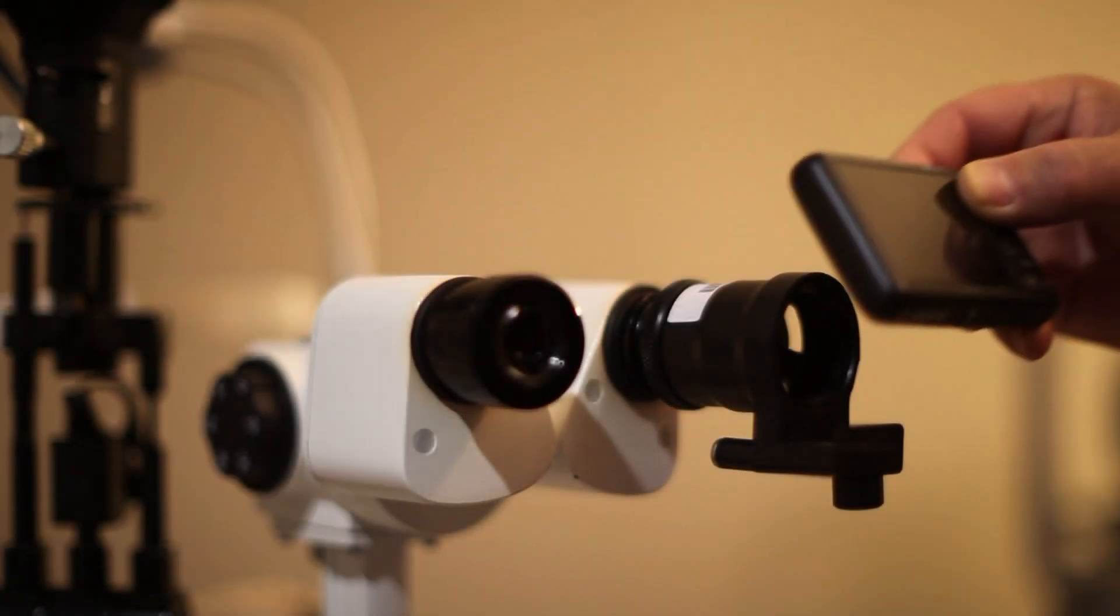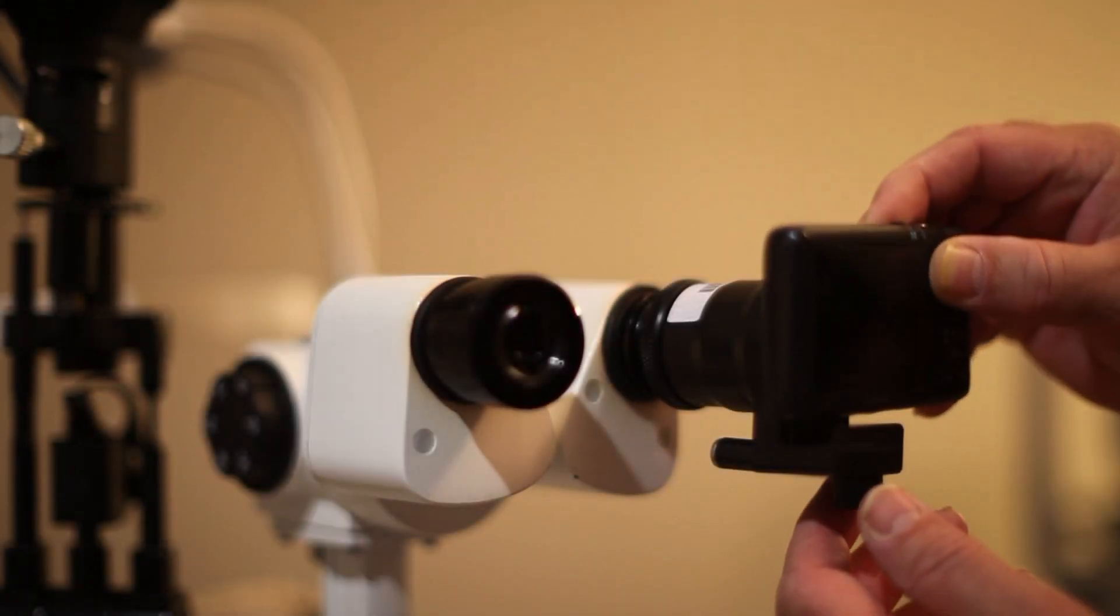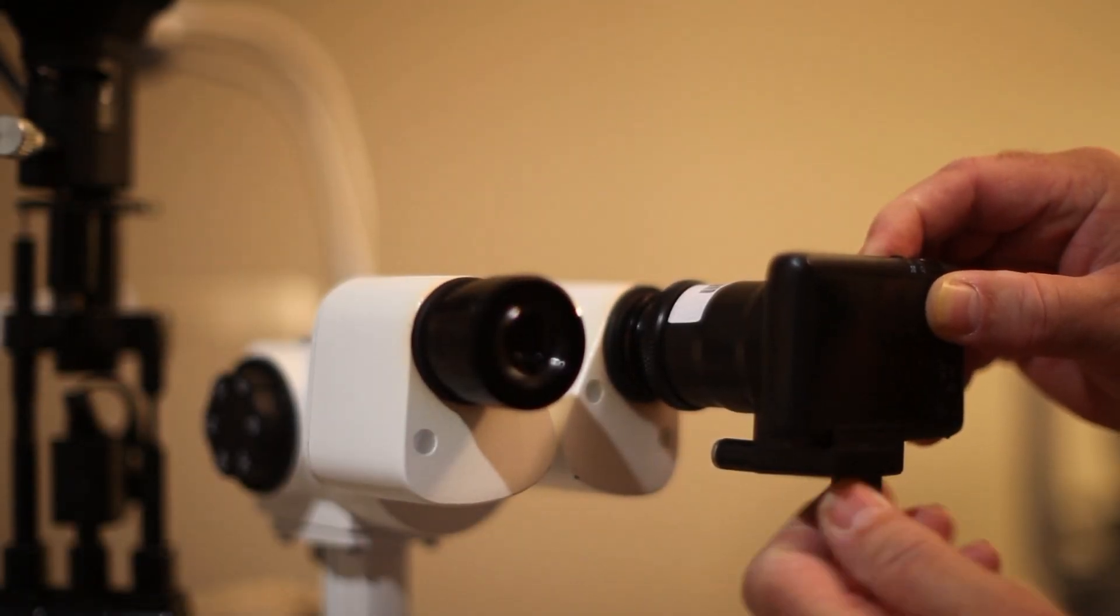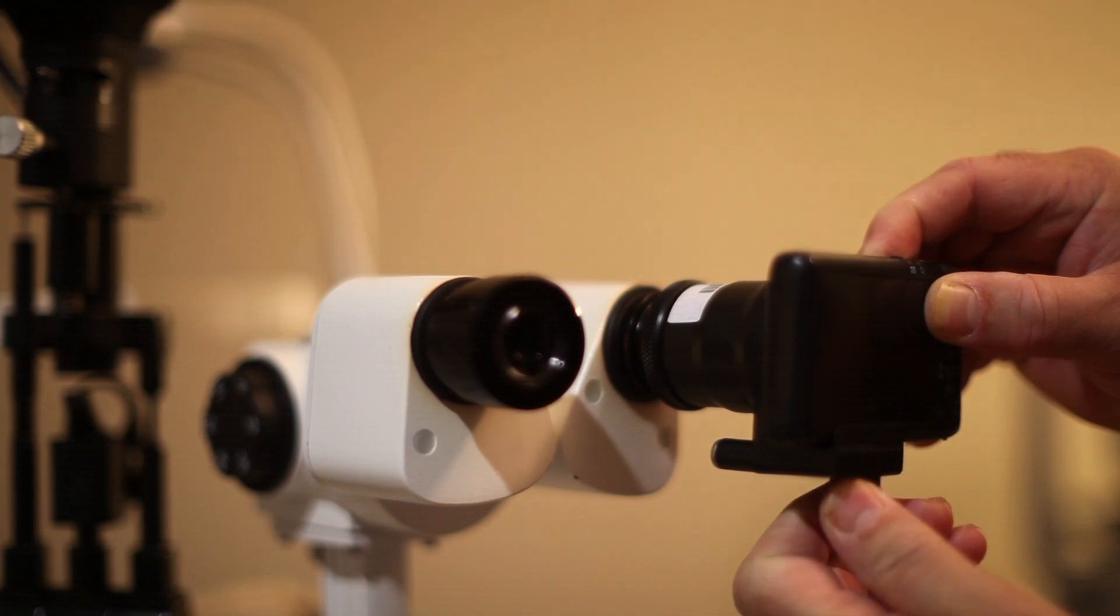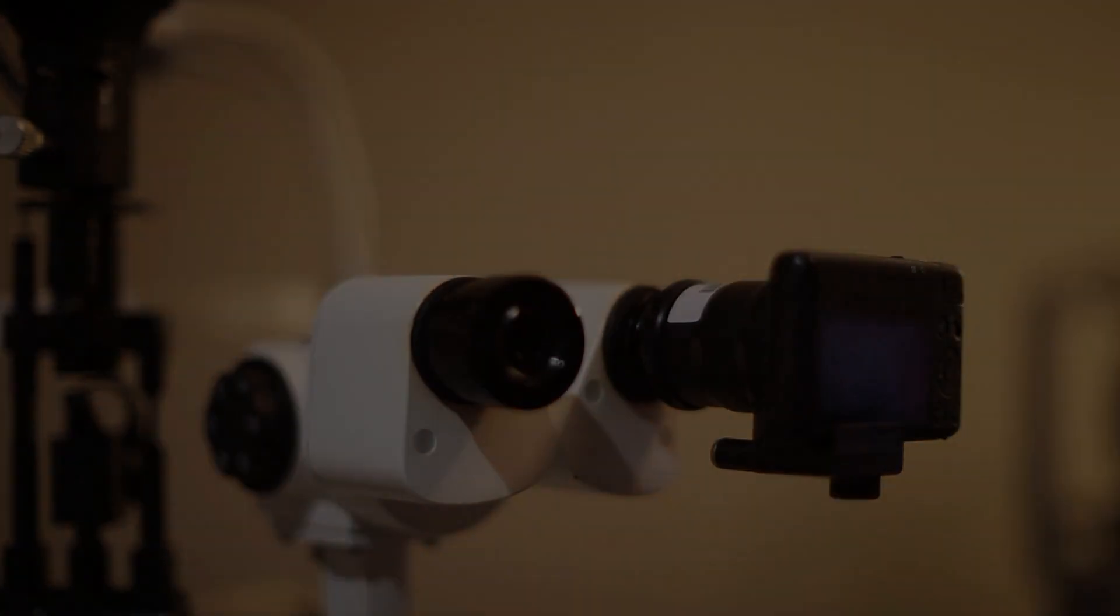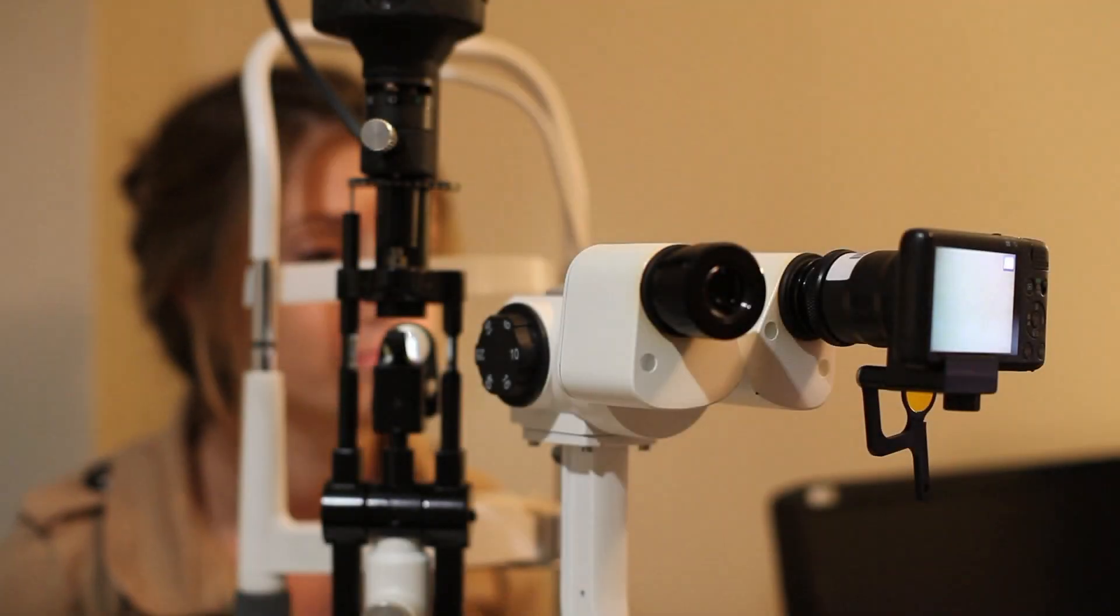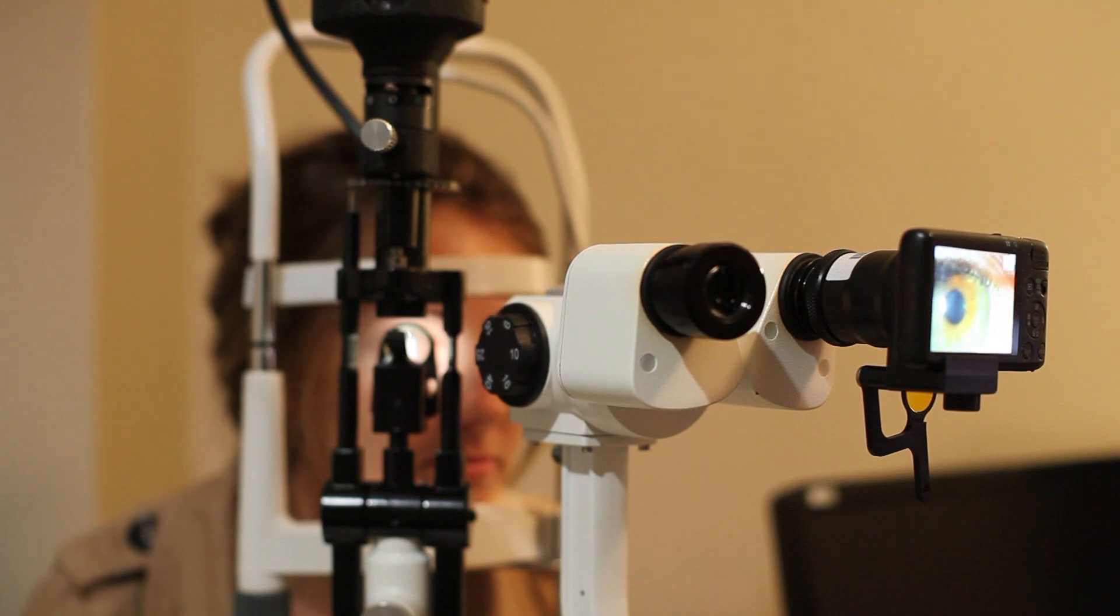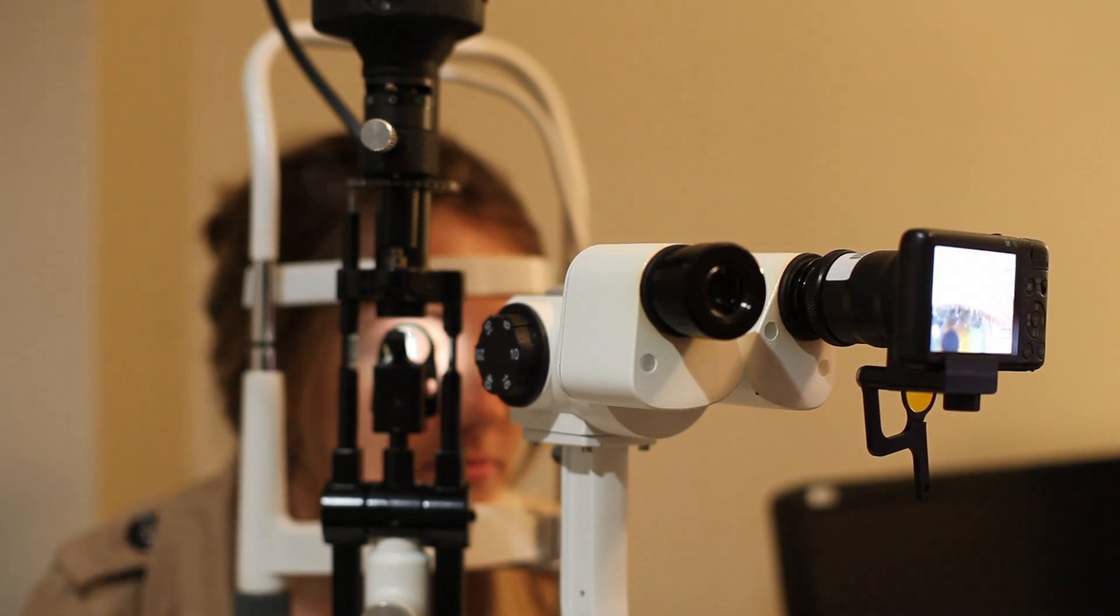Then return the camera to the mount. Now you can focus your slit lamp as normal and capture digital images.